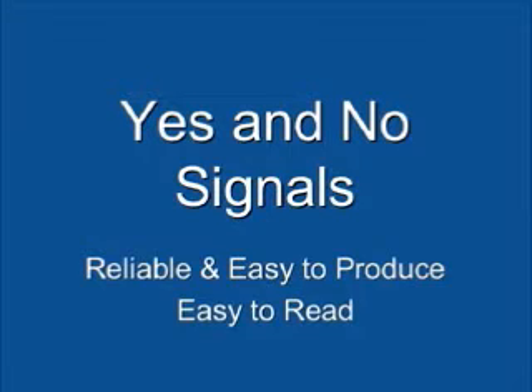First, in order to use the eye link board, it is important for the user and partner to establish yes and no signals. The user in this video uses a deliberate eye blink for no and a wink to indicate yes. Users should select one signal for yes and one for no. These signals should be reliable and easy to produce, as well as easy for the communication partner to read.